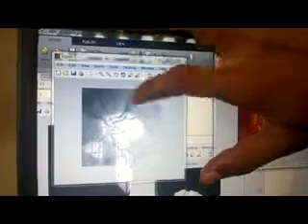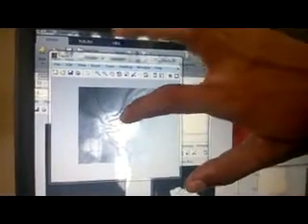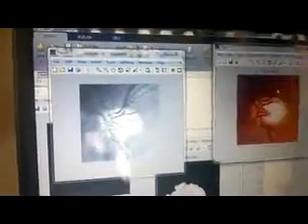First is the region of interest image. From the region of interest, we calculate the black and white image, where the brightest part is the disc, the optic nerve head. These are the fibers. Only the disc has the nerve fibers. The cup won't have them.